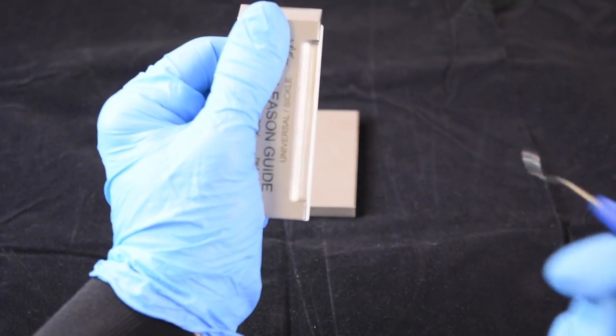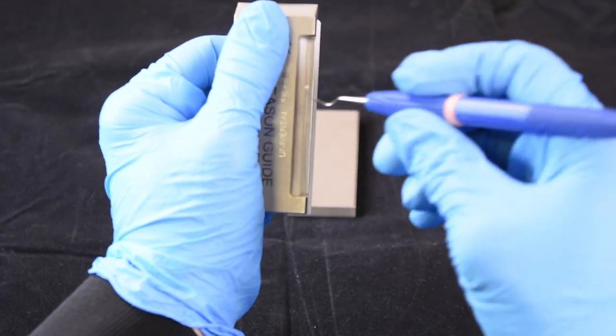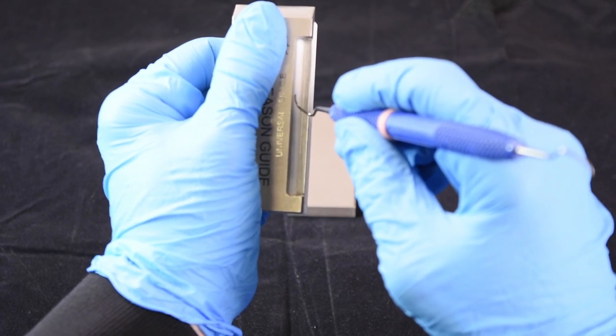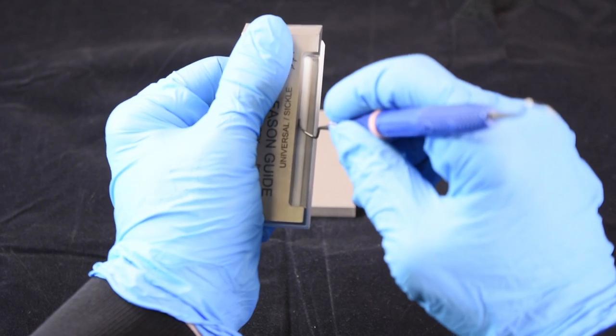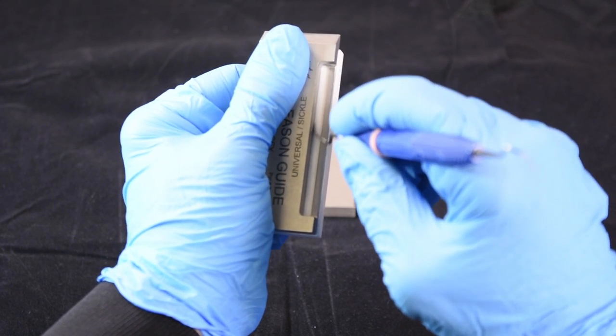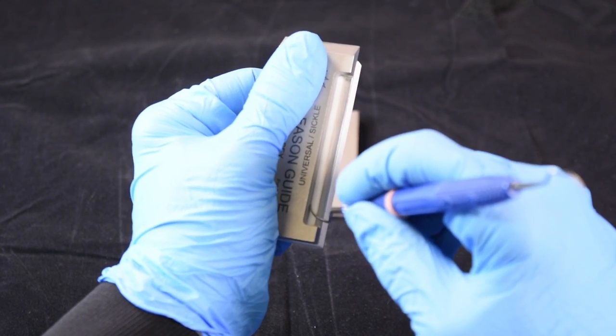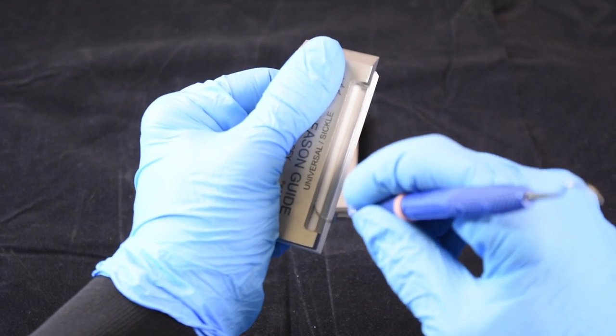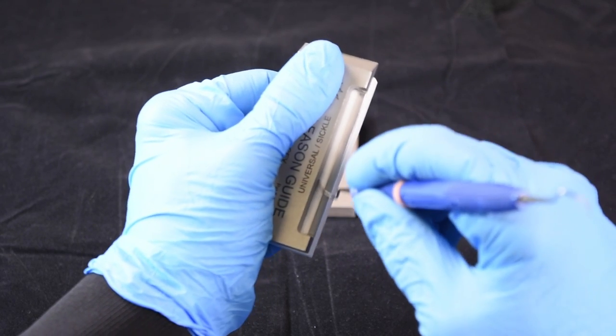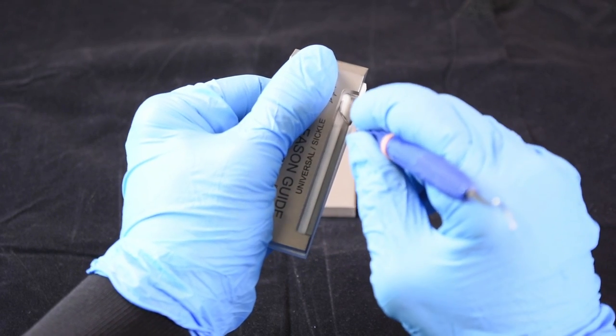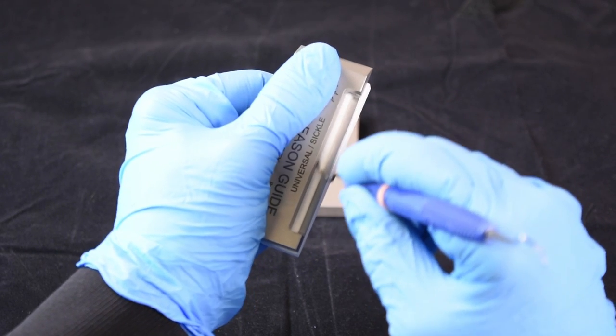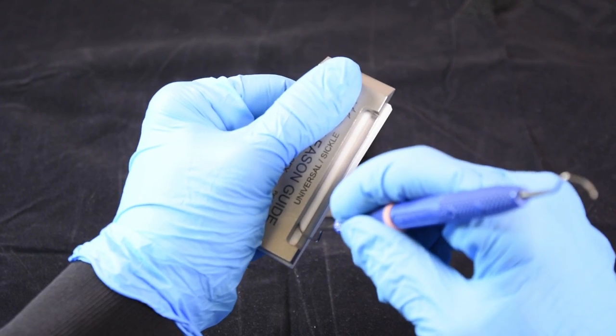Make sure that you have the universal side facing the instrument. Place the back of the blade against the stop, bring the terminal shank down to the rest, and glide. Glide using a pendulum motion so you get the heel and the toe with a nice even pressure.